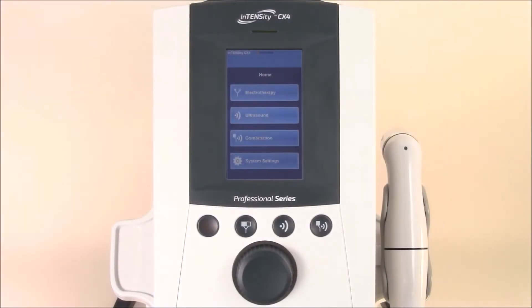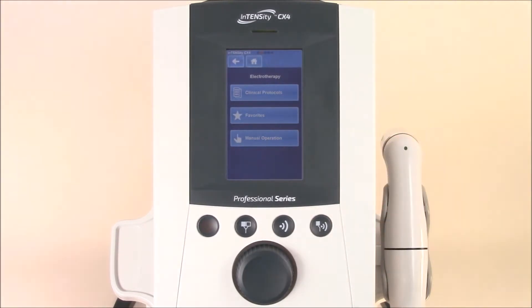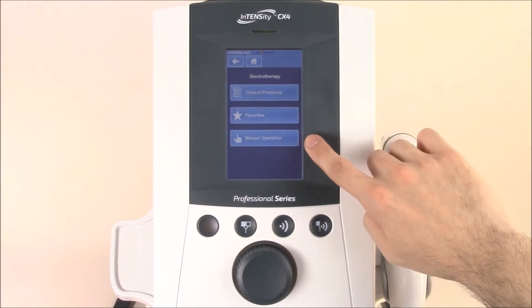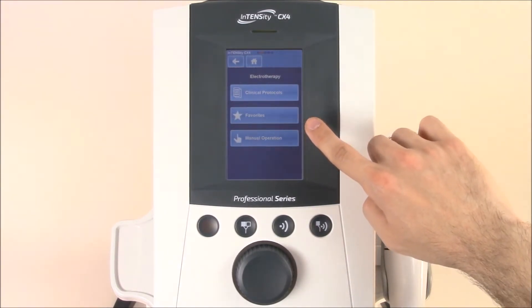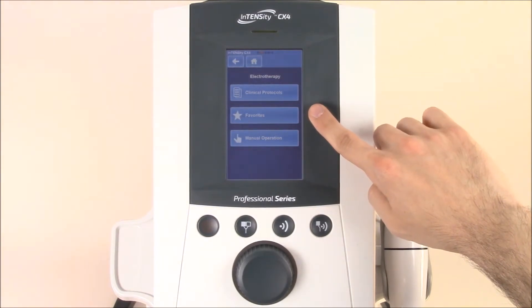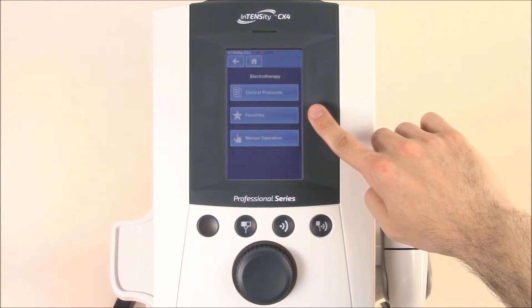Now that you're familiar with the quick access buttons, let's use the touch screen and dive further into the unit. First, let's select electrotherapy found at the top of the main screen. Simply hit the icon and it'll take you to the main page of the electrotherapy section. Here you'll see manual operations, where you can choose from all of your current waveforms, your favorites section, and where you can save different favorite protocols for various patients or therapists in the clinic, as well as your clinical protocol section that houses all of the protocols found on the device.